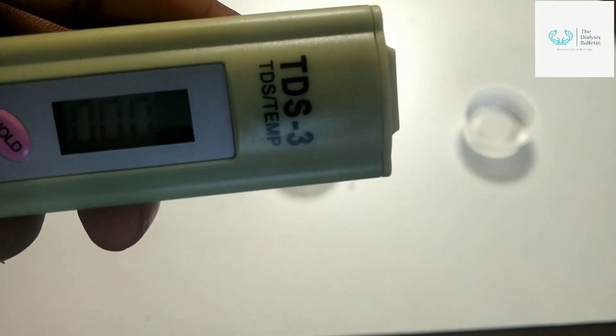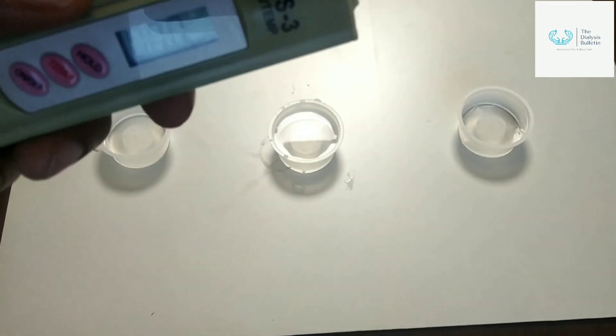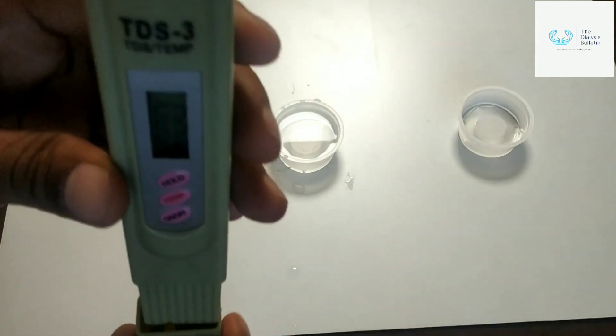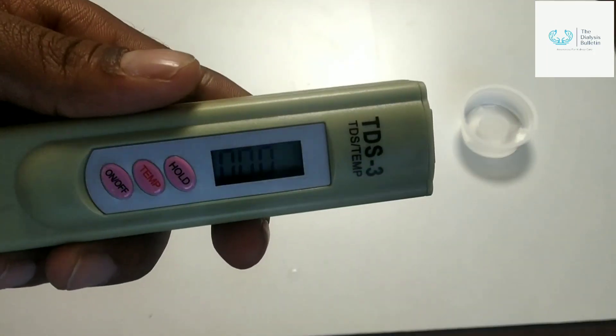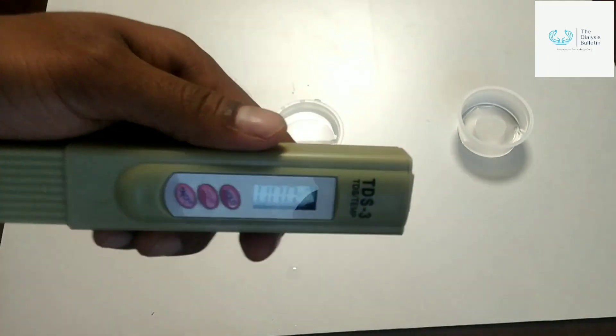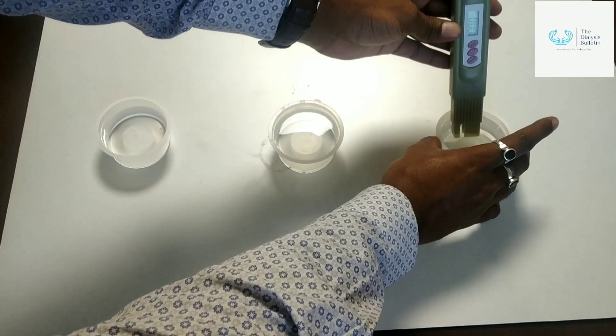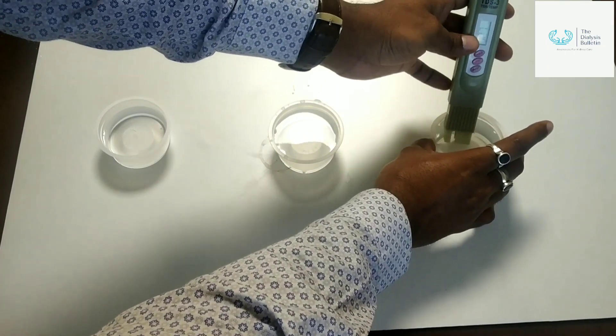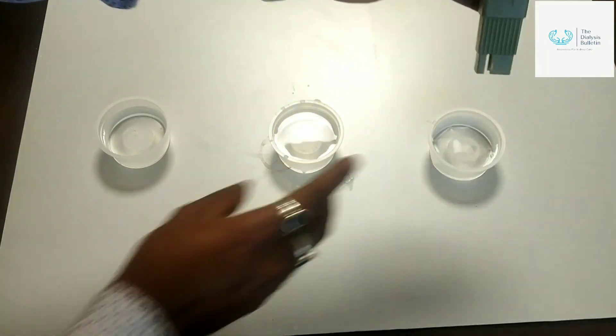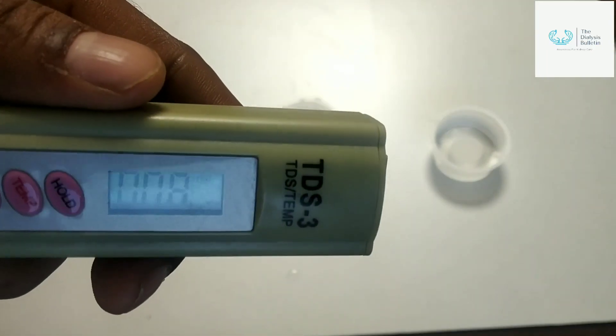If you're not getting zero or the neutral value, you have to clean with distilled water or RO water, then you will get the zero value. Now I am going to check the RO water. It's now 8 PPM.